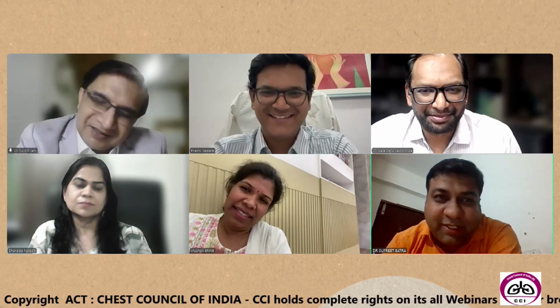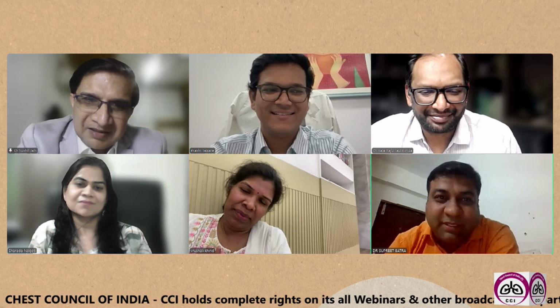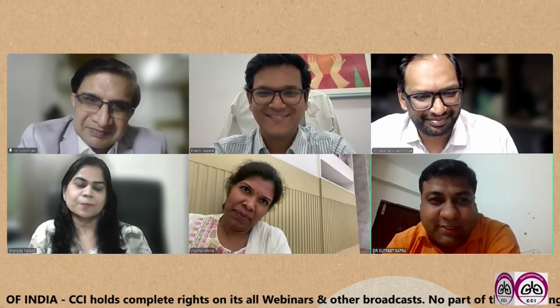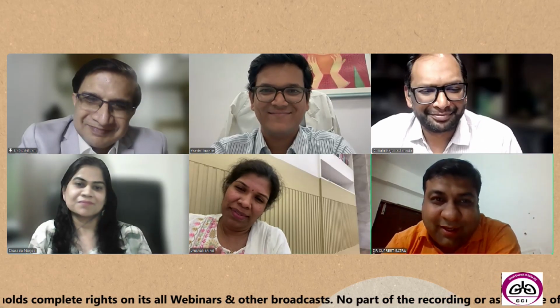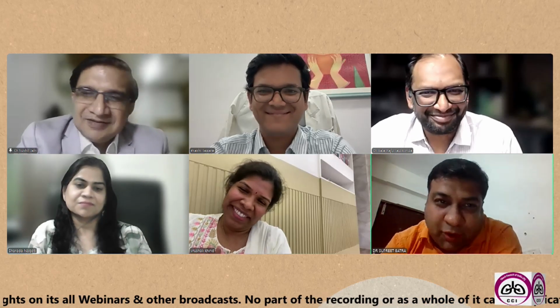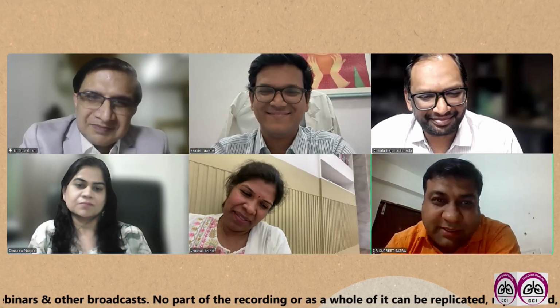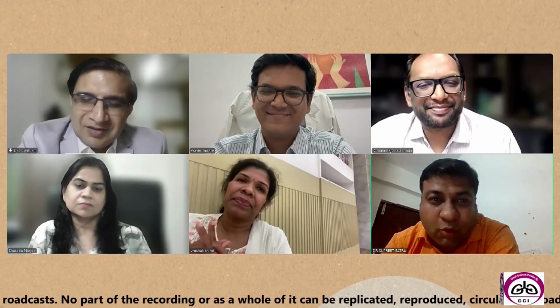And I always want to ask for a cell block, because whenever I had a discussion with pathology, you also say we'll do a cell block, you give more sample, cytospin. So that's what we always discuss, have a good relationship, but we call it CRP: clinical, radiological, and pathological correlation. So we discuss with radiologists. Even for my bronchoscopies, I go and see the CT scan, which lobe, which segment, and that's how it increases my yield of bronchoscopy rather than roaming here and there.